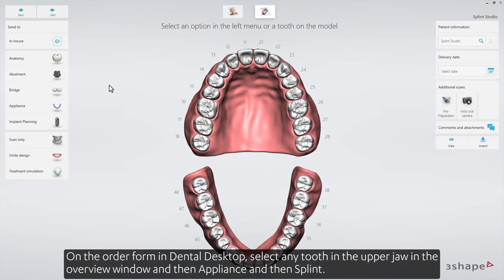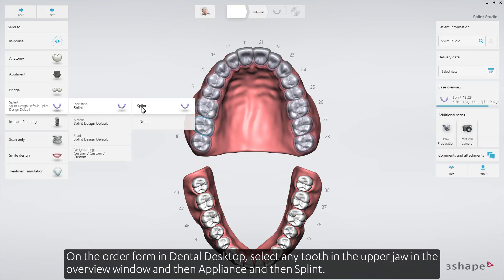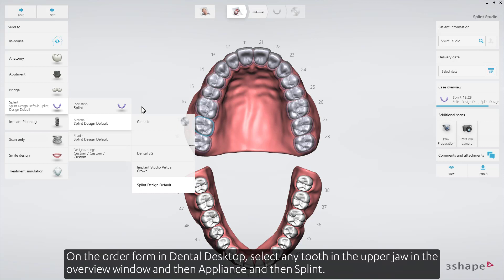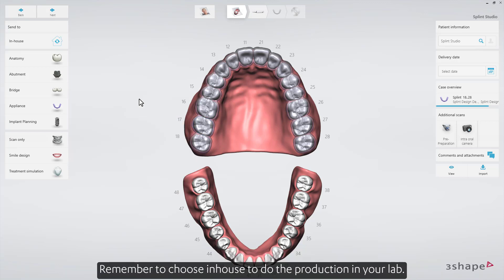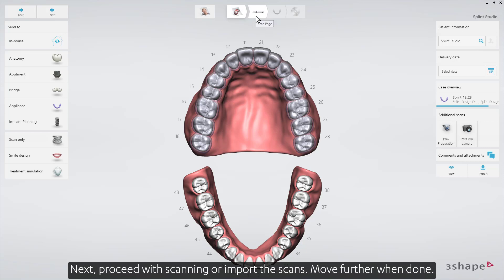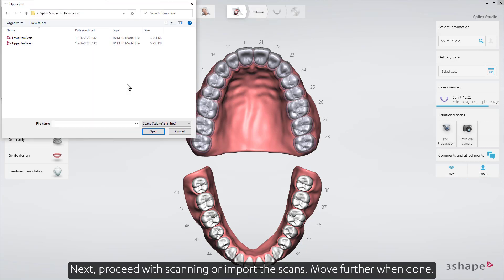On the order form in Dental Desktop, select any tooth in the upper jaw in the Overview window, and then Appliance, and then Splint. Remember to choose In-House to do the production in your lab. Next, proceed with scanning or import the scans. Move further when done.